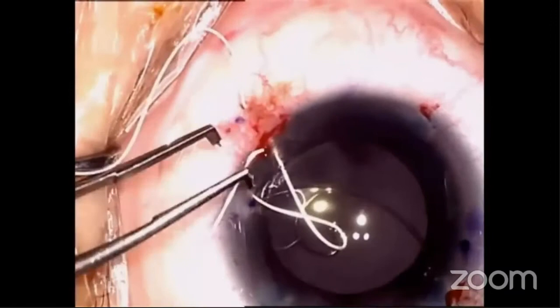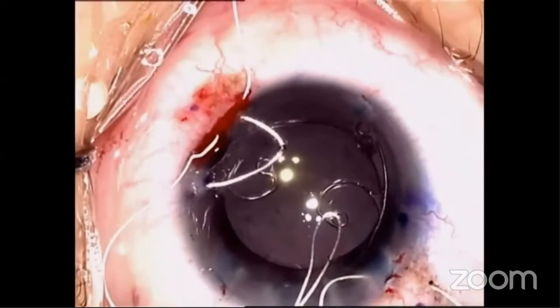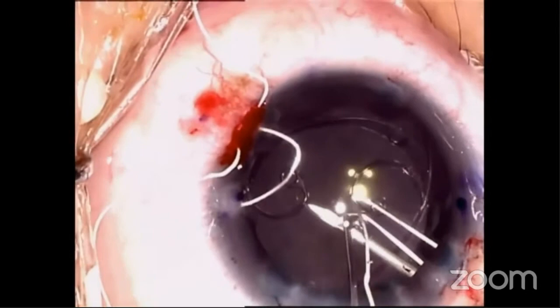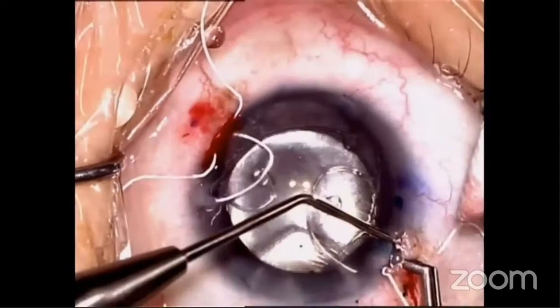So we then retrieve the sutures from the Hoffman pocket and adjust the position of the capsular tension segment into the bag, and we repeat this for a diametrically opposite position so that we have a good support of this lens complex. So we are now retrieving the suture ends with this extended loop of suture which lassos the end of the suture to the fixation point at the sclera. Now once we have done that, we retrieve again the sutures from the Hoffman pocket, and we are going to ensure that we have no vitreous left in the anterior chamber before we fix this.